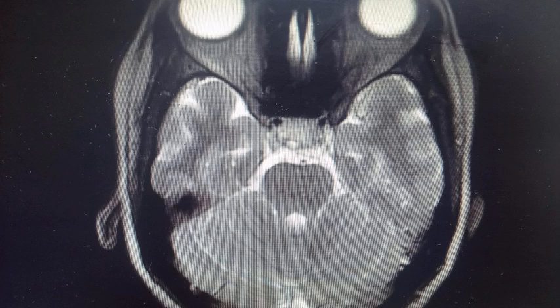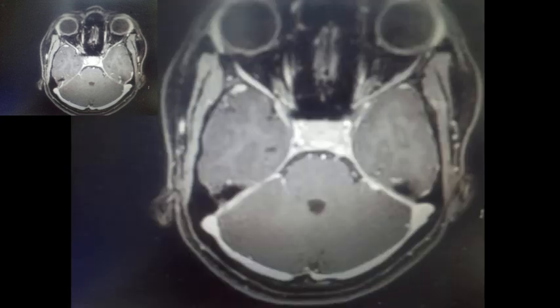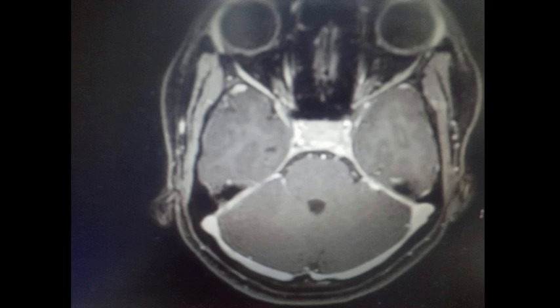Contrast pictures were remarkably important, as there was brilliant enhancement of not only the sellar lesion but also the surrounding dura, which is not normal for pituitary macroadenoma or pituitary adenoma as such, where there is heterogeneous enhancement and the surrounding dura does not enhance.